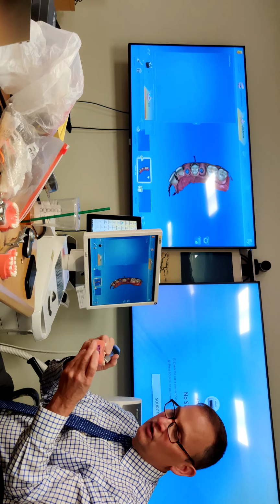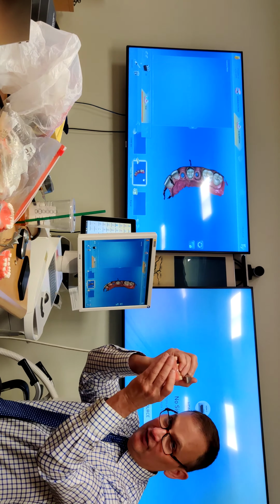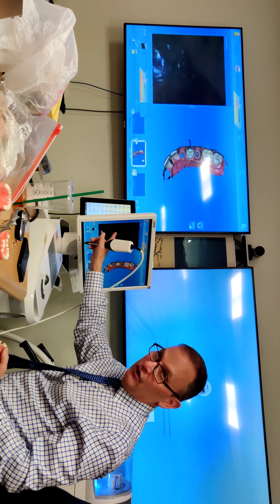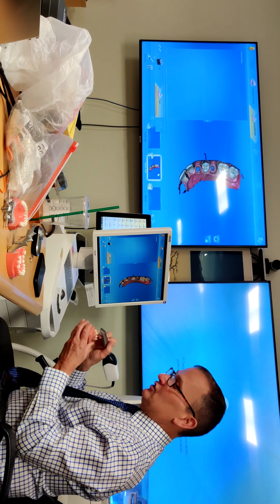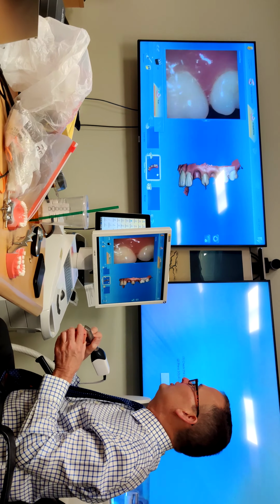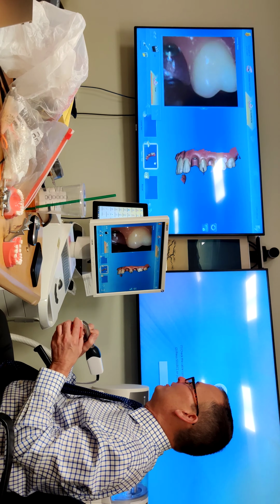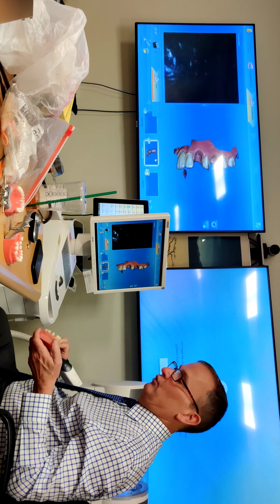When you're scanning, don't look here. This is the tendency, residents: the tendency is to look in the mouth. Don't look here either. Look here, and see what data you have. Watch again. Do you see the white? I'm there, but I'm not getting there. This is what it's showing me I'm capturing. That white area. So watch here. Okay, we're done with that.